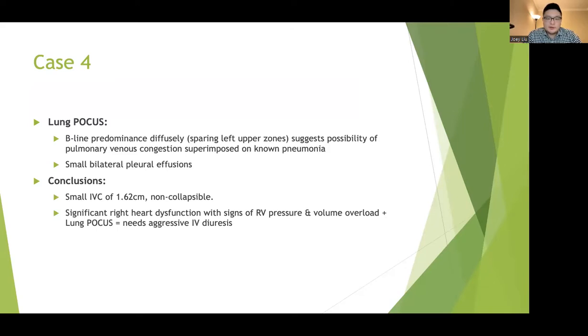And this is a clinical scenario which might be quite uncommon, but commonly encountered in management of these types of complex right heart dysfunction patients, in which the IVC assessment alone would definitely not be enough to guide a clinical judgment because of their existing right heart function.